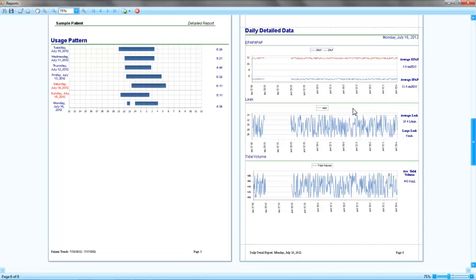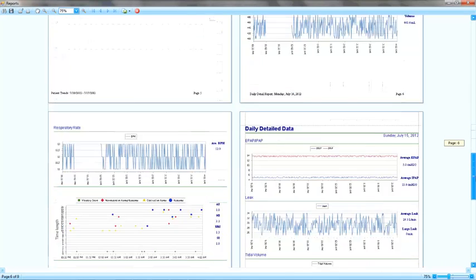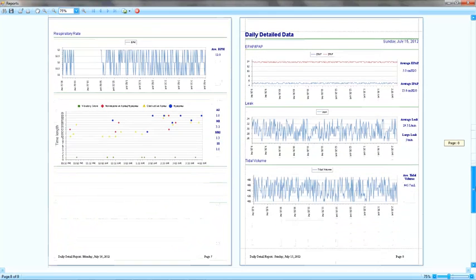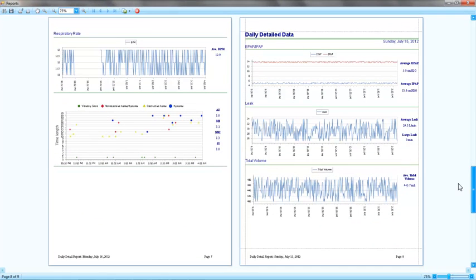3. Tidal Volume. Tidal Volume changes during the night can be seen on this graphic. 4. Respiratory Rate. You will see the respiratory rate changes during the night. 5. Respiratory Event LENGTH Map. This chart shows the respiratory events occurred and their lengths.